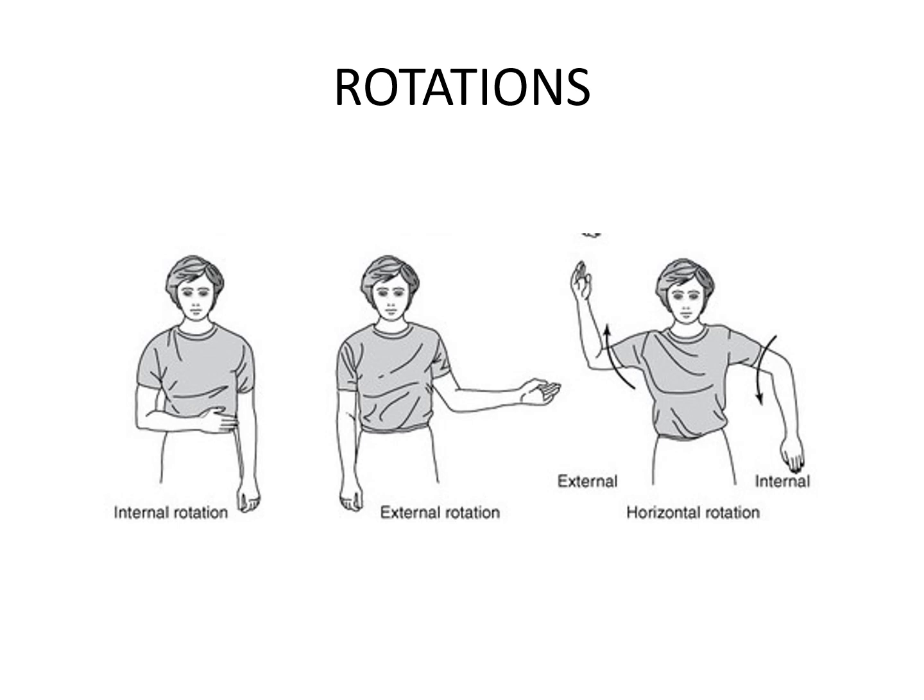The third position is shoulder at 90 degree abduction. 90 degree abduction is the position where maximum rotation of the shoulder happens. You can see in the figure how much the person is able to rotate internally and externally. At 90 degree of shoulder, when you take the arm inwards, it is internal. When you take it upwards and away from the body, it is external rotation.